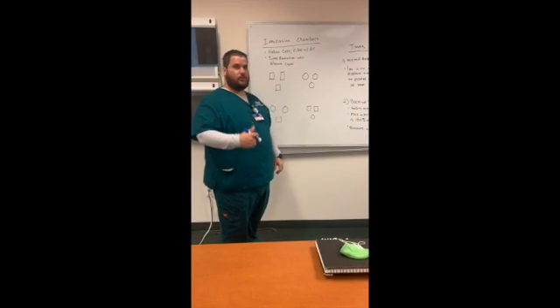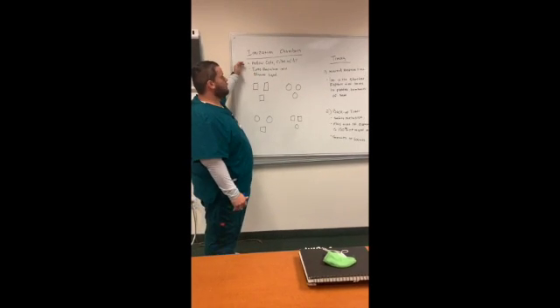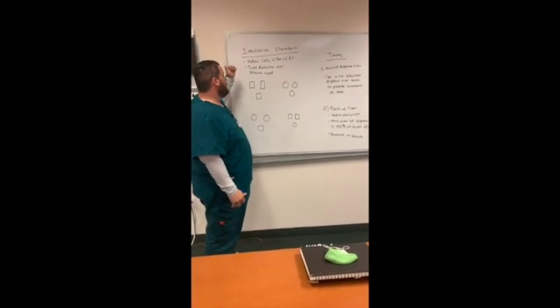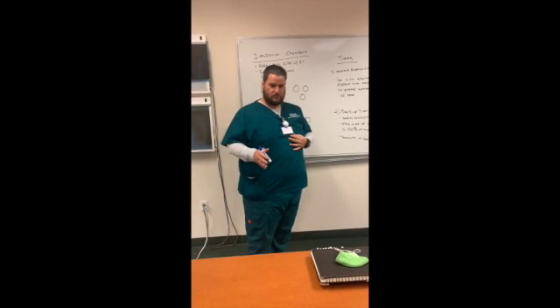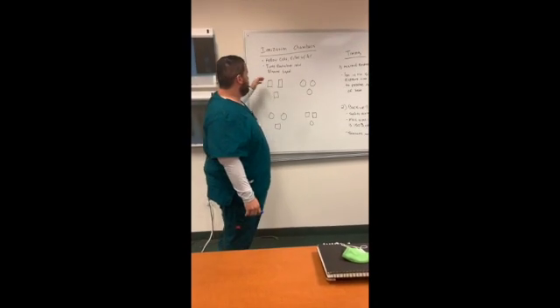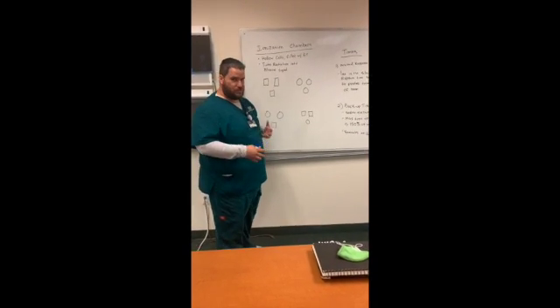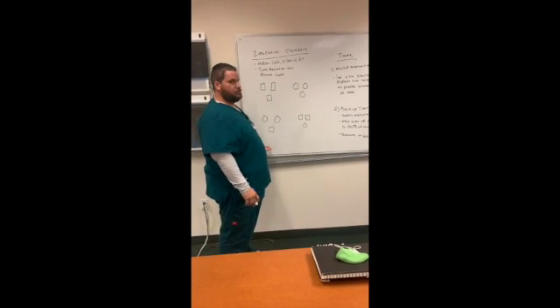And now we're moving into the ionization chambers. These chambers are hollow shells filled with air that turn radiation, like X-ray photons, into electrical signals. These are the configurations of how they look. They might be all squares, circles, or a combination of the two.